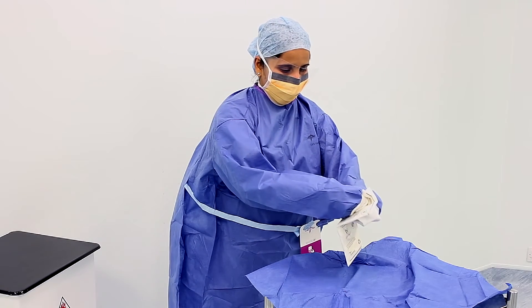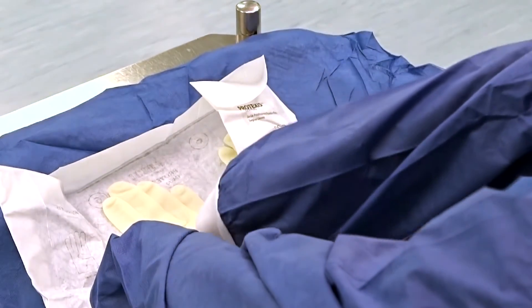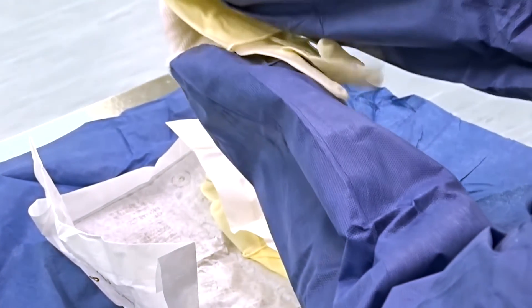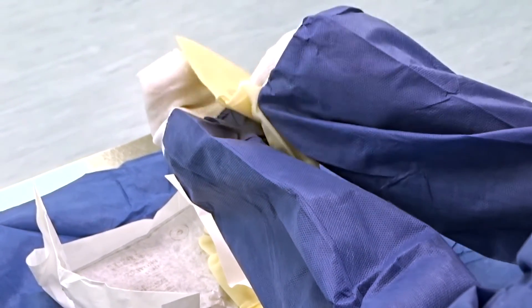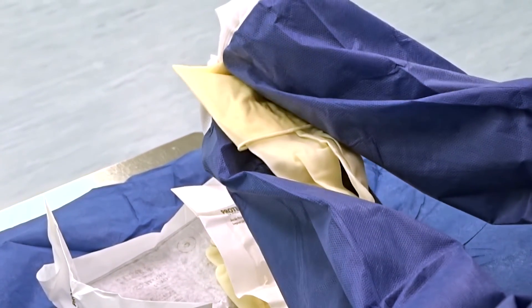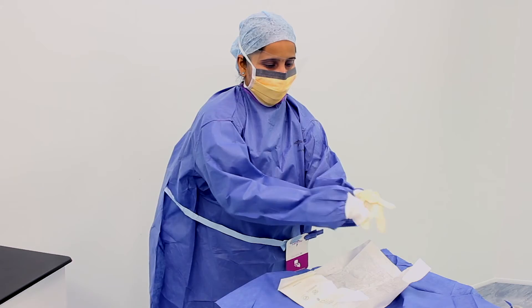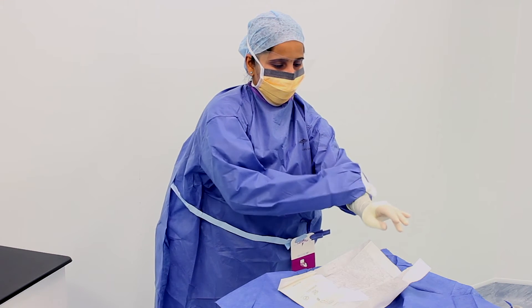Donning of the gloves is performed using the closed gloving technique. We start by opening the inner glove pack with the gloves positioned with the fingers away from us. Whilst continuing to keep our hands within the sleeves of the gown, we pick up the left glove using our right hand. The left glove is then laid upon the covered palm of the left hand, with the fingers facing towards us. If you are left-handed, the right hand glove can be picked up instead and placed upon the right palm, again with fingers facing towards us. Holding the glove in the right hand using a pincer grip, the glove is then peeled back over the left hand, which remains in the sleeve. As the hand fills the glove, the glove is then completely unpeeled to cover the wrist.